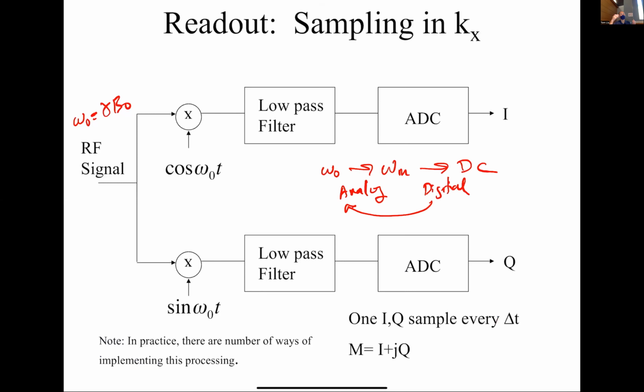There are people trying to actually sample the waveform at that 127 megahertz or whatever. Or if you're doing low field MRI, portable MRI, then you can just do everything digitally. The advantage of digital is that everything is just math; it's very precise. In analog design or circuit design, things depend on temperature, and there are all these effects.